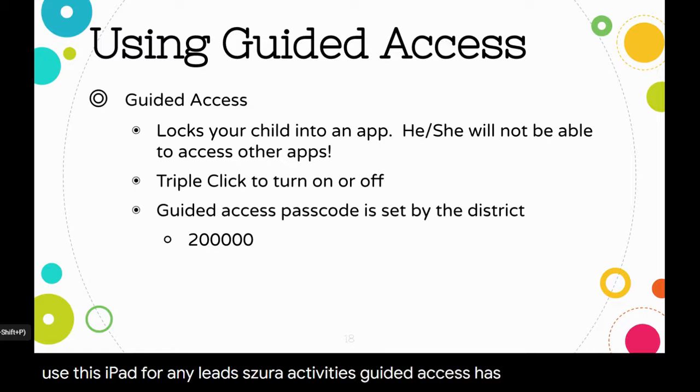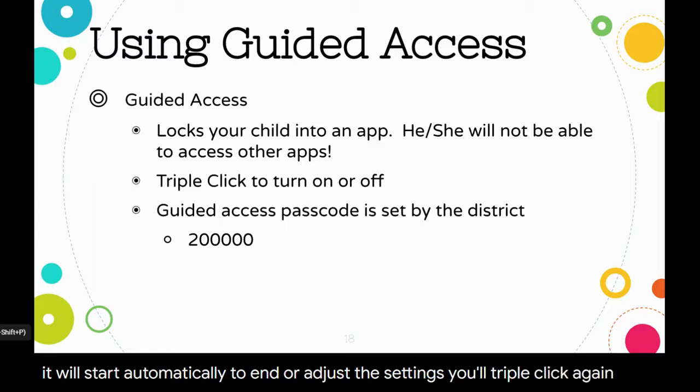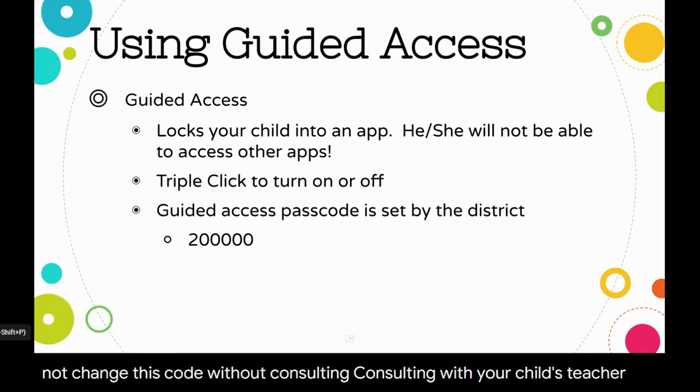Guided access has already been set up on the iPad. To start guided access, you'll simply triple click on the home button and it will start automatically. To end or adjust the settings, you'll triple click again and input the passcode set by the district, which in this case is 200,000. Please do not change this code without consulting with your child's teacher or SLP.